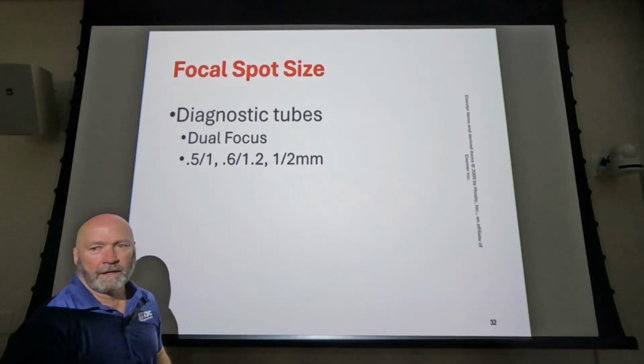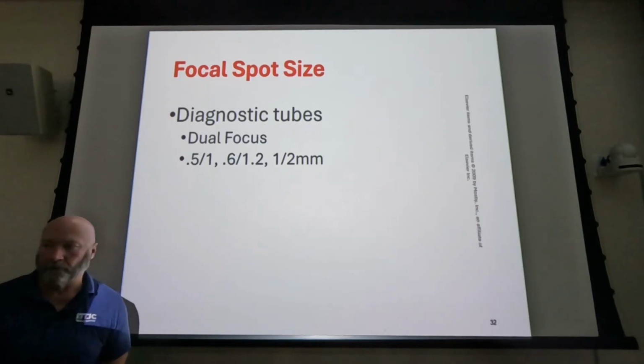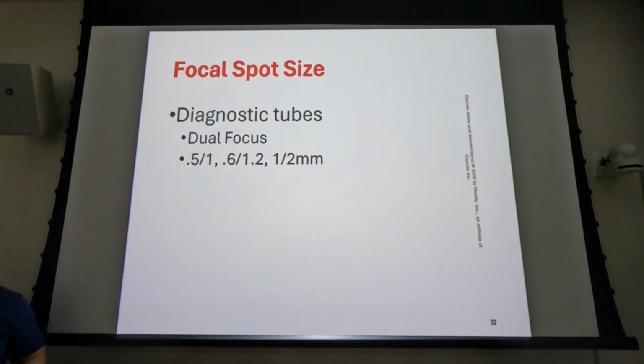The little one, right. So where we want to use large focal spot is where we're going to have high heat loads. So you want to use large focal spot on hands? You don't need to, right? What's your hand exposure? 2 mAs, right? Very low mAs.